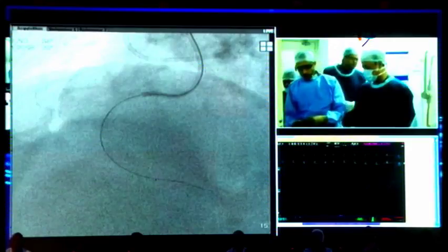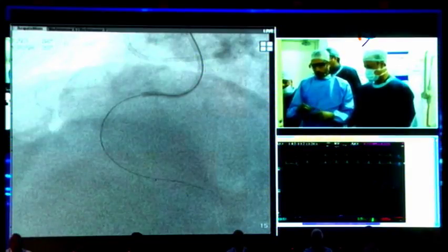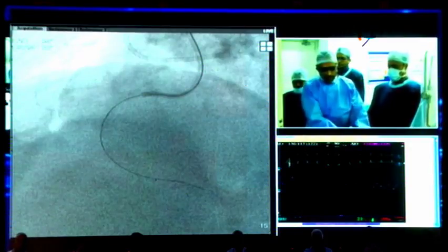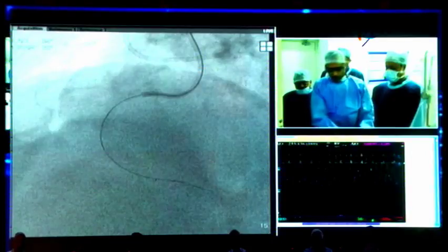So it's not going to give me great backup, but I have to, like I said, either a bailout or use what I have. It's okay. We'll see how it does. If it doesn't, then we will move on. So we are kind of running out of Fine Cross and Corsairs here.